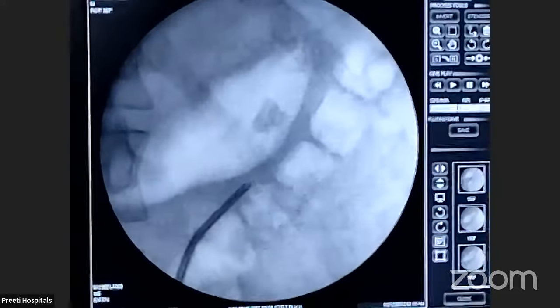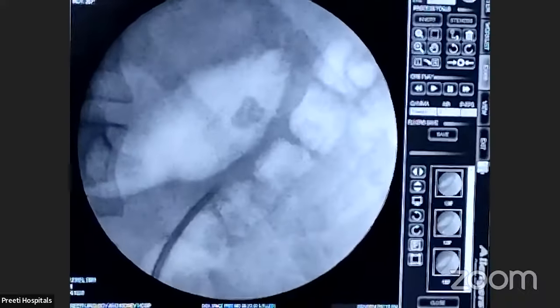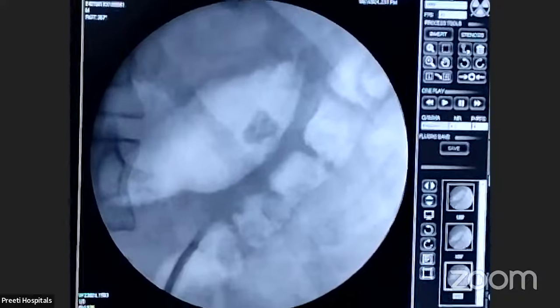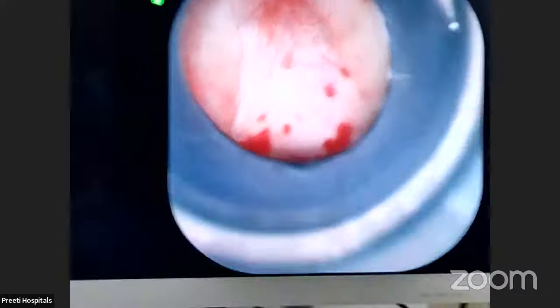See, at this level, and there, here, hold it. The sheath. So you should be careful here in the PUJ region. So I am just falling short. I can push inside and finish. That means a 50 centimeter sheath.